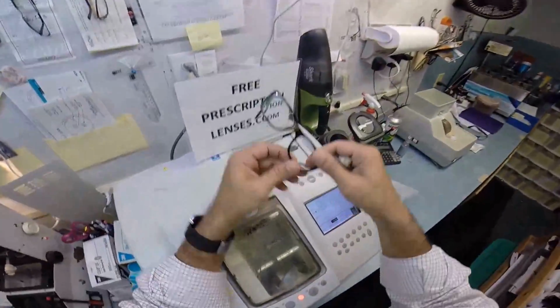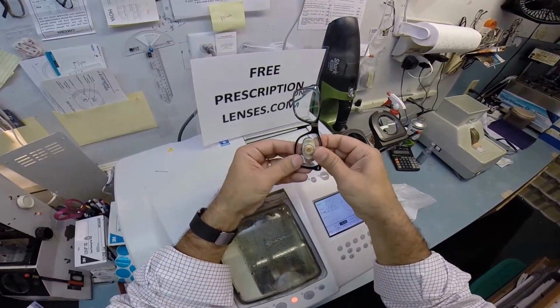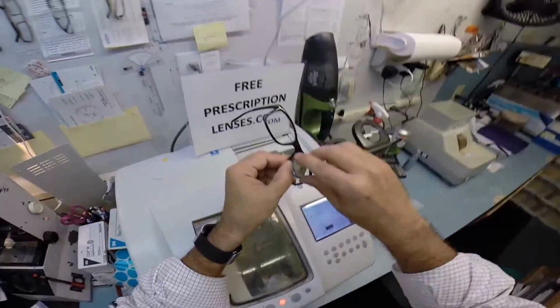Okay, where's your frame? Here it is. So let me go back over here. Now, I've turned the frame around this way. I have the empty side closest to me, and I tuck it in at the outside corners first, and then use my thumbs. I press down at the nose and it snaps right in.